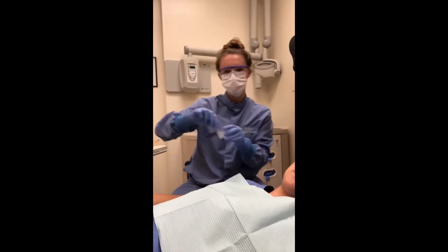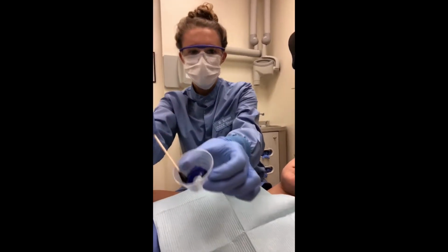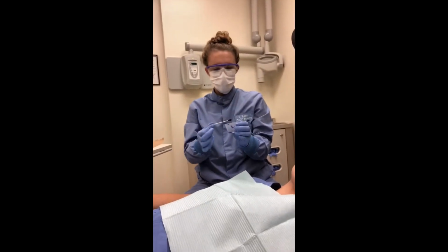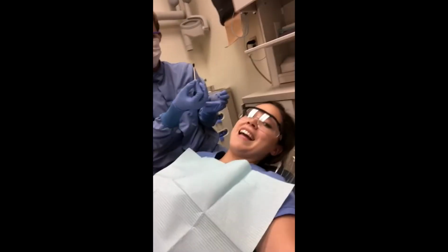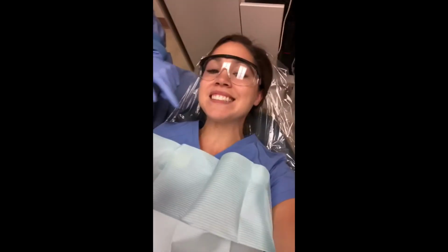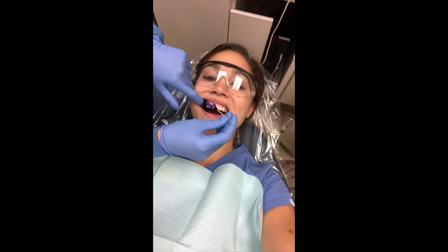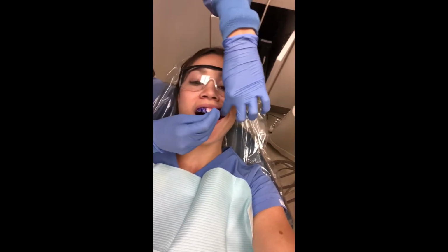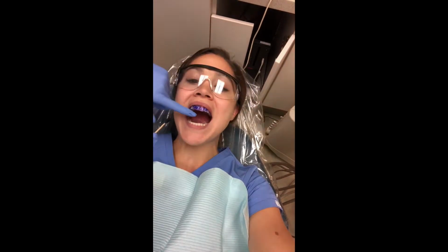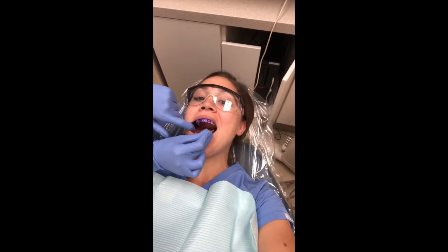All right, so for our supplies, we kind of already went over this, but you'll need a cotton tip applicator and then like a little medicine cup so you can get some disclosing solution. And then your patient has their napkin and eyewear on. And then you just rub the disclosing solution on the patient's teeth. Open your teeth. And you put it on the facial and on the lingual, because remember we're going to record all of these on our plaque index.